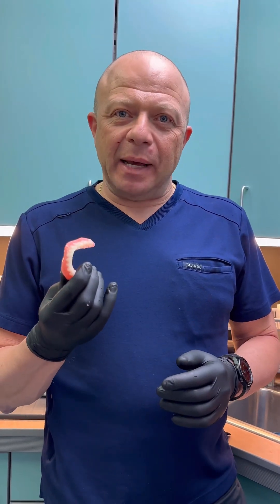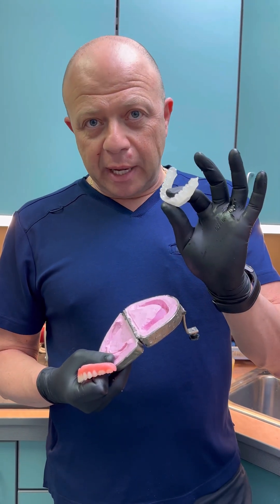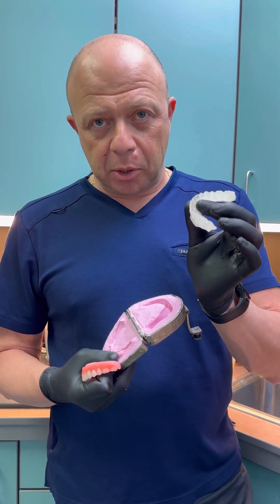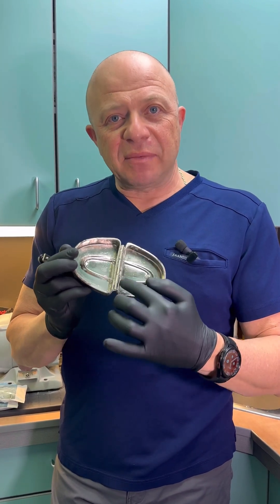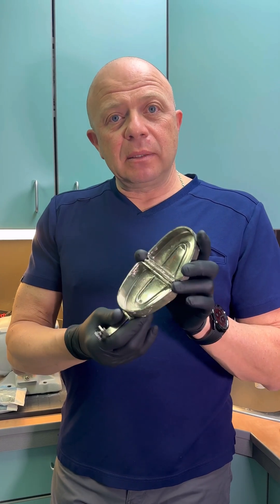Denture duplication is key. Today I do it digitally — I will scan this and my laboratory can produce a beautiful milled or printed denture quickly. But knowing how to do this in the laboratory can save you time when you don't have a connection to the digital lab. Having this copy handy is excellent because you can produce a surgical guide, and we'll go over how to prepare it with the proper markers, and of course a copy of the denture in the proper color for use during treatment or for the wedding tomorrow. Last but not least, clean everything out — take all the alginate and acrylic out, make sure you got it out of the seam and out of the hinge, and Vaseline a little bit on the inside the way we did before, close it, and get ready for the next one.